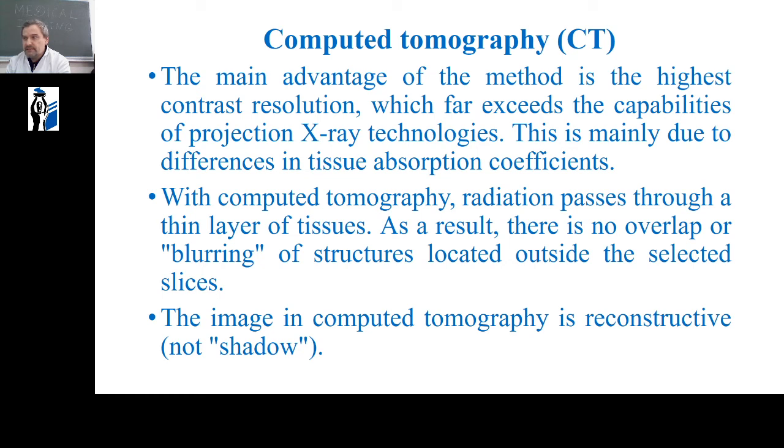This is mainly due to differences in tissue absorption coefficients. With computed tomography, radiation passes through a thin layer of tissue. As a result, there is no overlap or blurring of structures located outside the selected slices.